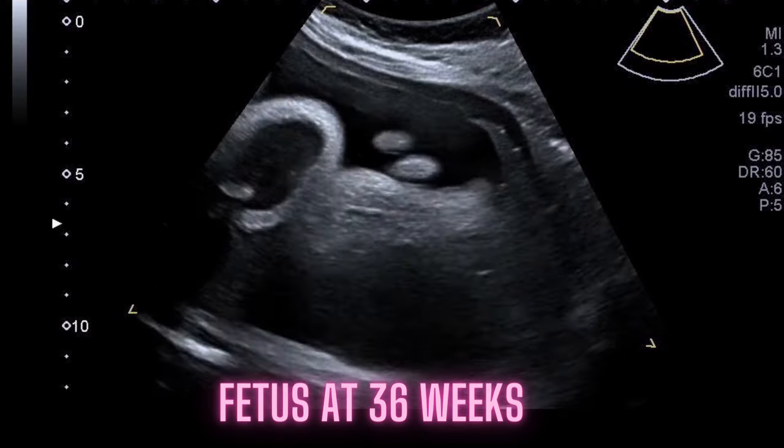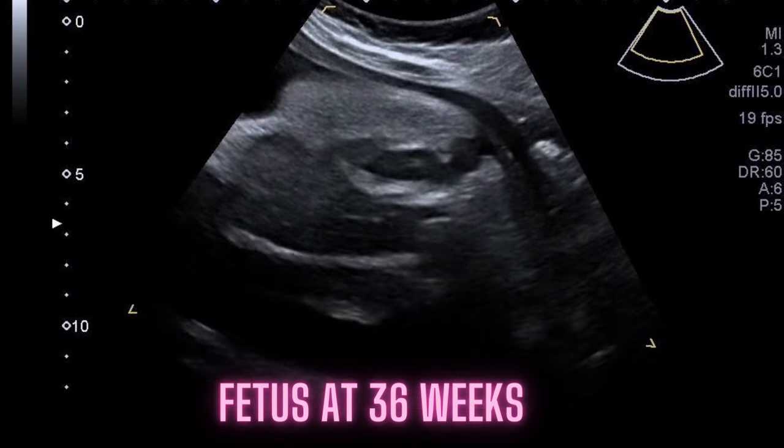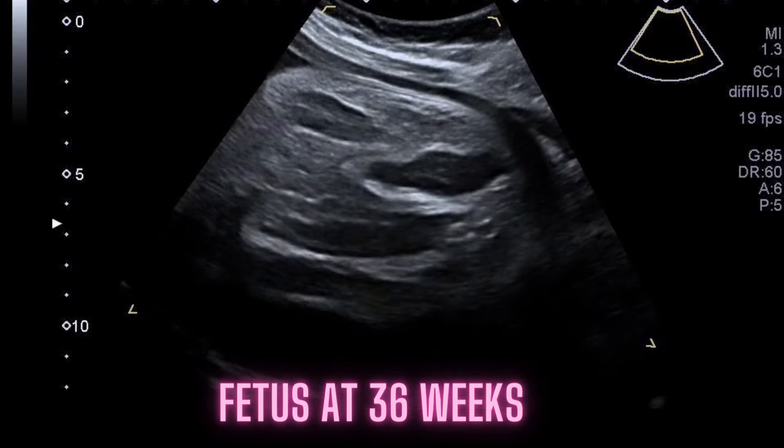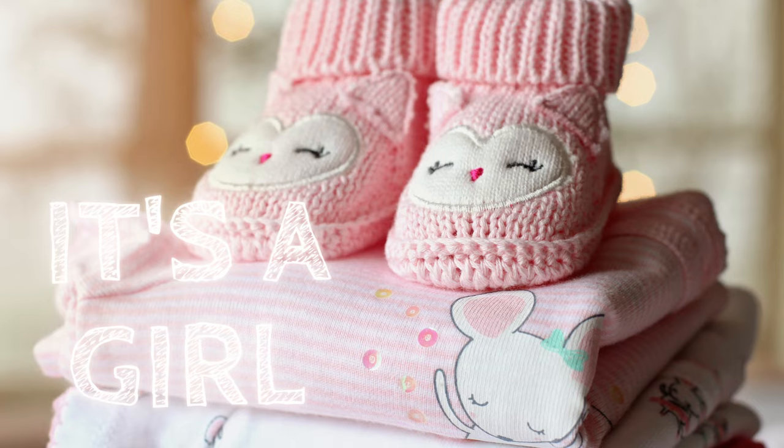This is a 36-week-old fetus. You can clearly see the labia between the thighs. No male genitalia seen. It's a girl.